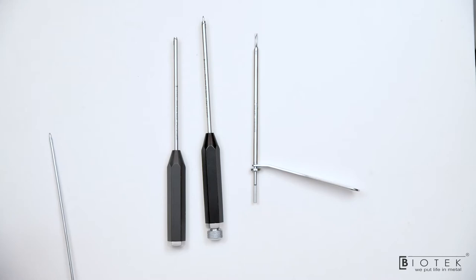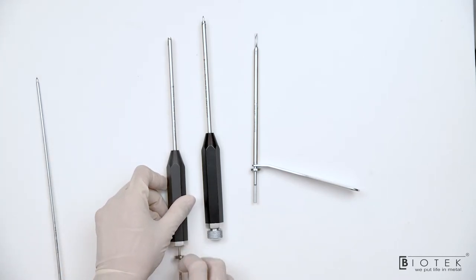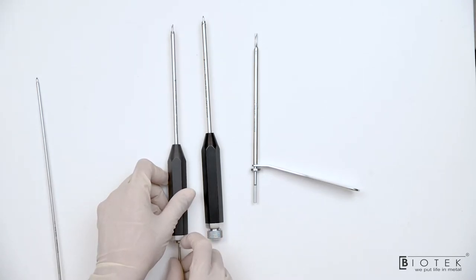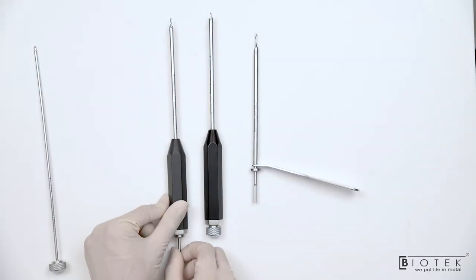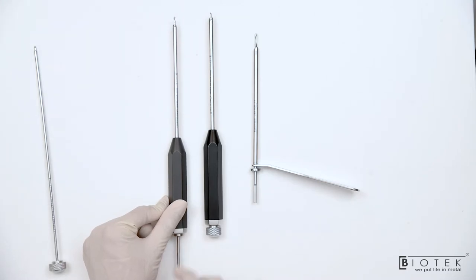After removing the trocar you can insert the anchor specific drill bit to create a pilot hole in glenoid, and it has an auto-stopper so that it will stop once the desired length is drilled in the bone.